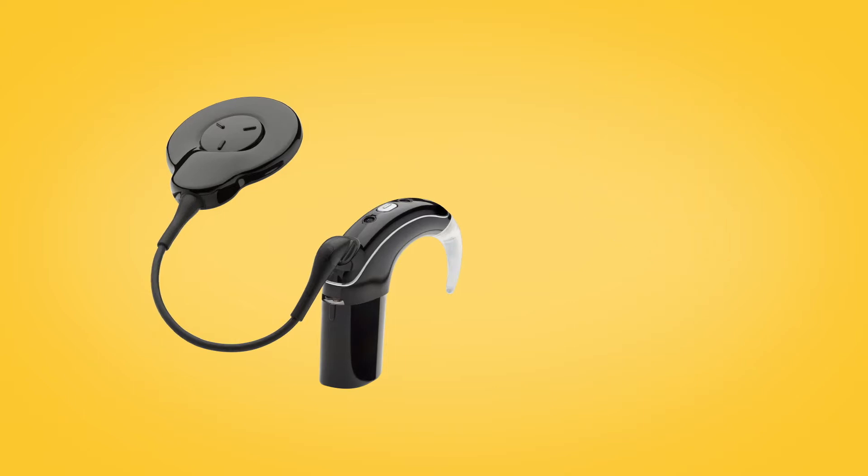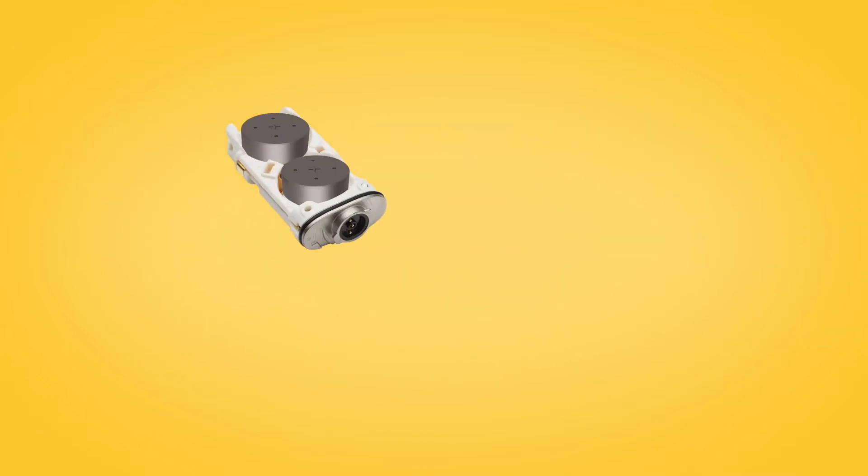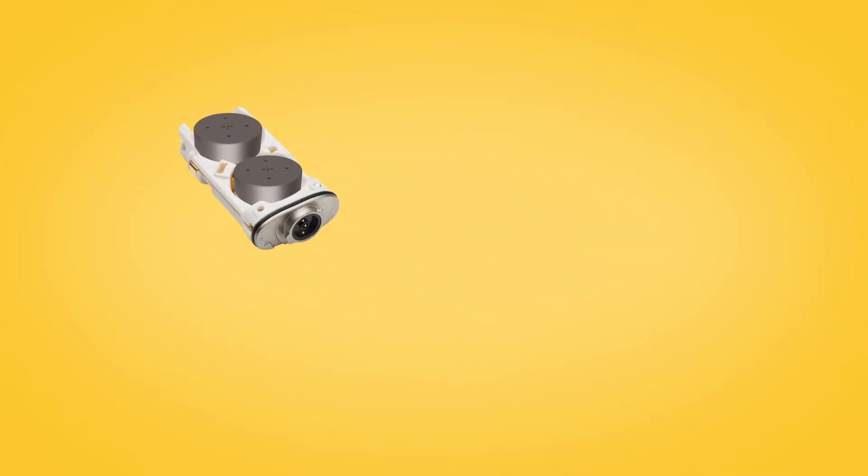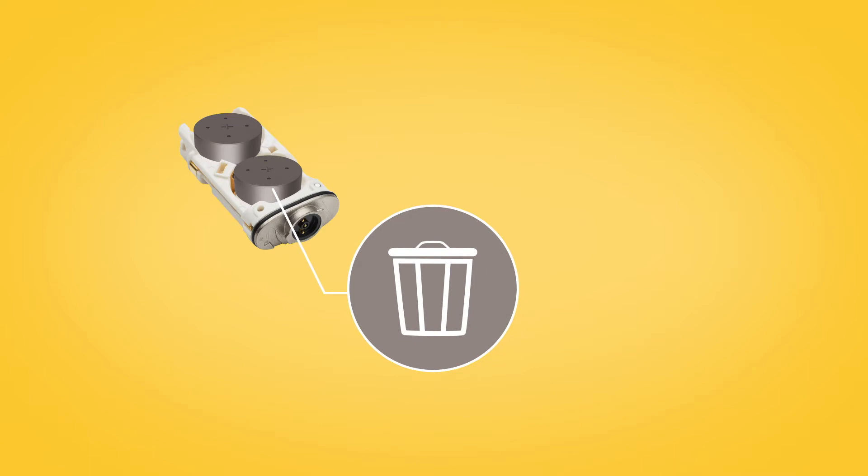For long-term storage, you should remove disposable batteries from the battery module before storage.